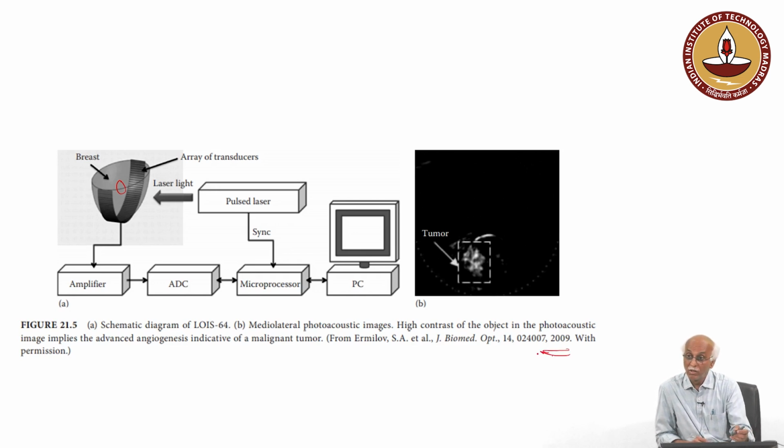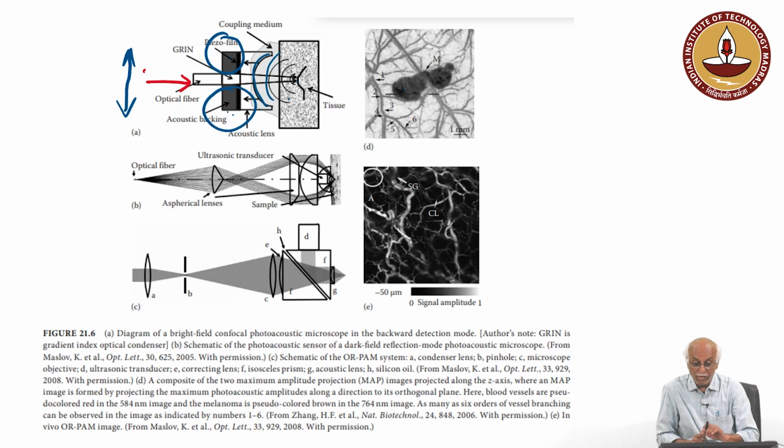Many research groups wanted to acquire not only the imaging part but also to distinguish different tissue samples. In fact, some research groups have also combined this laser pulse with, let us say, the blood absorption wavelength. So, you can even take an image of the vessels through which the blood is going.